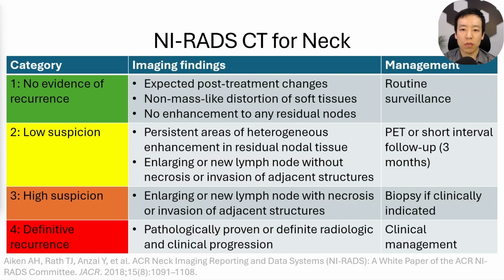NI-RADS 1 for the neck on CT consists of expected post-treatment changes, non-mass-like distortion of soft tissues, and no enhancement to any residual nodal tissue that was abnormal on the pre-treatment imaging. The management recommendation is to obtain routine surveillance.